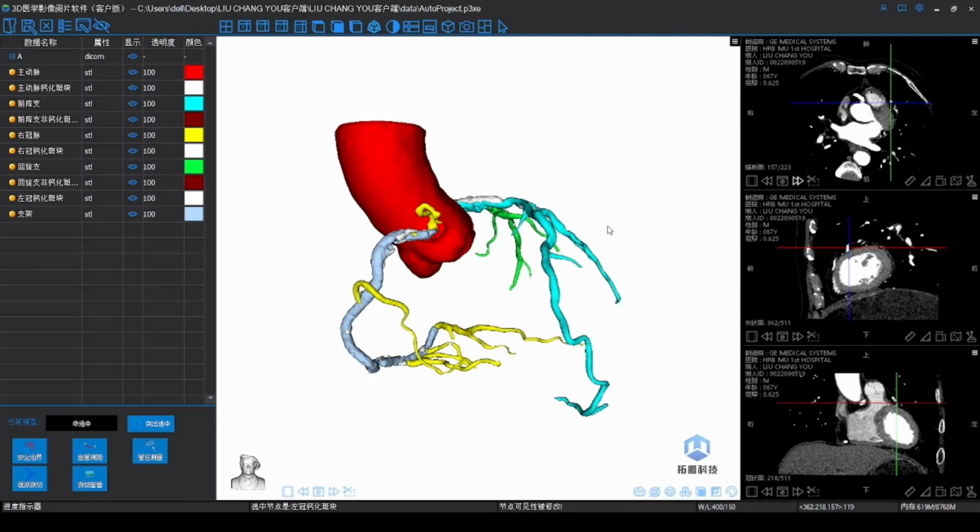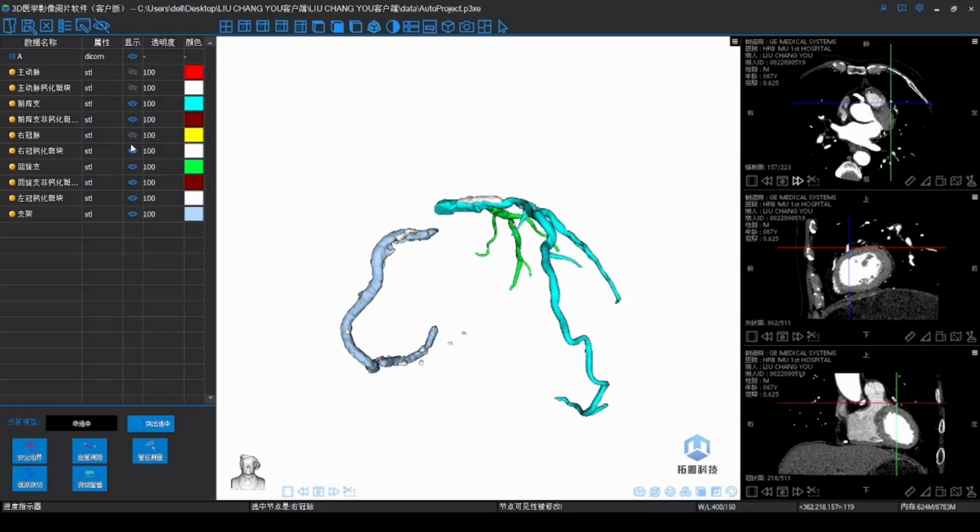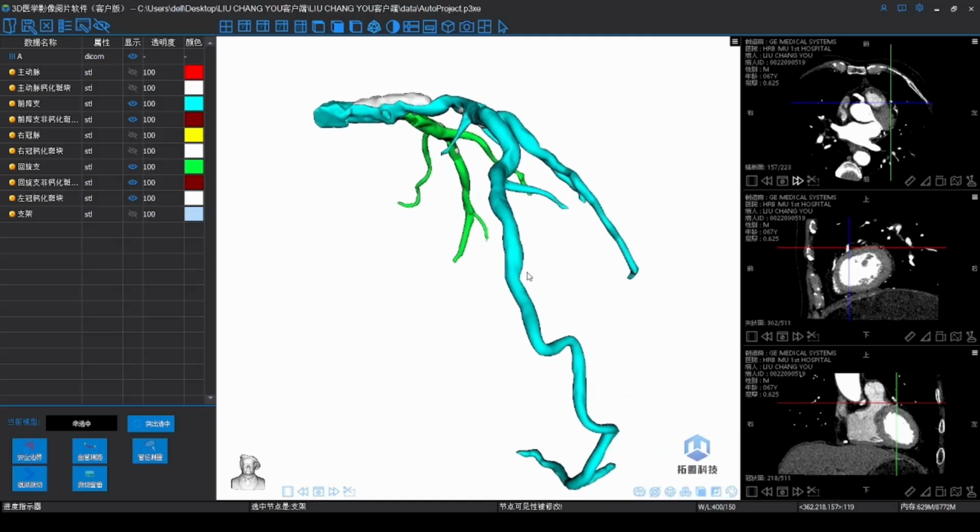Thank you, Professor Zhao. Now I will introduce the intelligent visualization system for coronary CT angiography, which is an original technique by Professor Li Yue. We have shown this system several times in the previous cases. Now we have the aorta and its calcified plaques. We see the right coronary artery with a full metal jacket stent, and we have the right coronary artery and its plaque and the stent, and enlarge the left coronary artery.